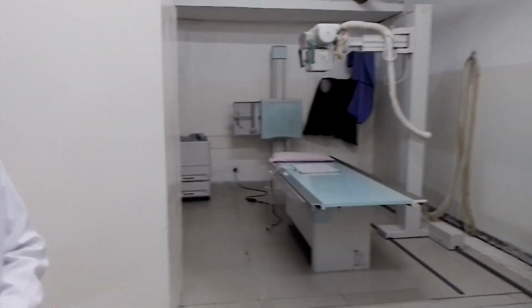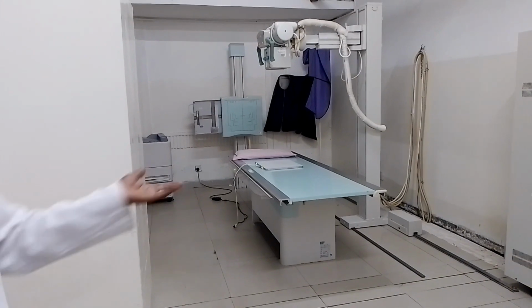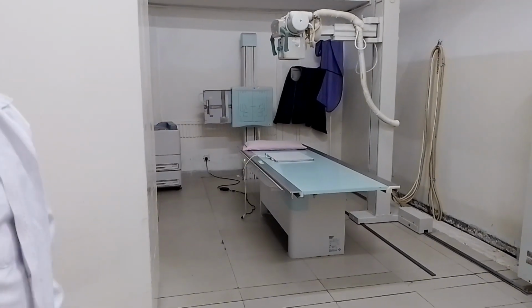So hand and foot are on the bed. Yes, on the bed: hand, foot, abdomen, and the head. You can do it here, you can do it there. Like SMV, for the sinuses, you do it up there.